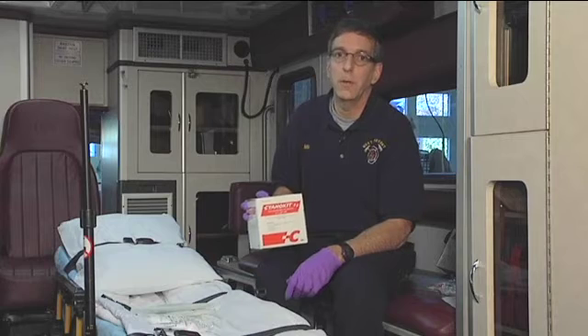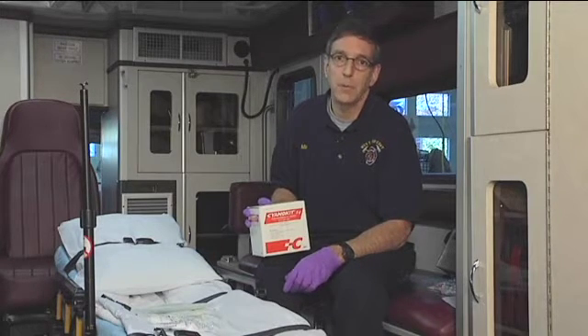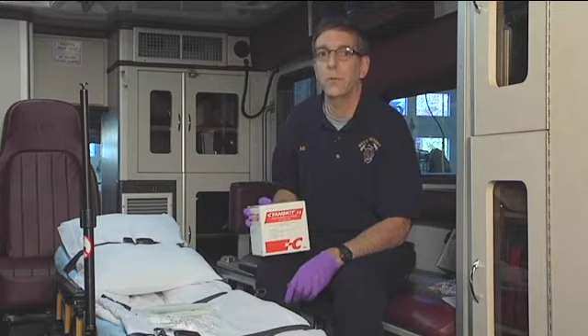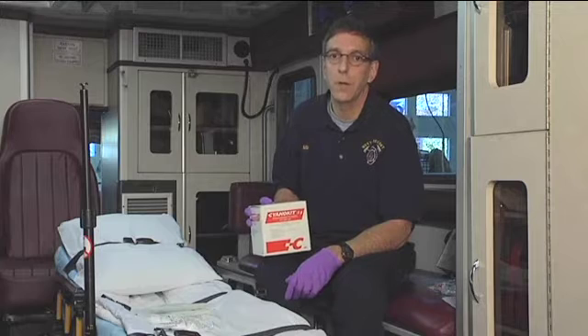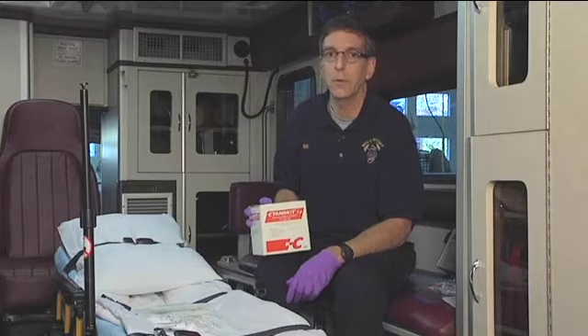You're going to end up giving this kit in an ALS setting to a patient who's probably in cardiac arrest, not the best of circumstances to have to work. So today I'll go through how to mix the drugs together, how to set up the kit, and get it ready for administration when seconds count.